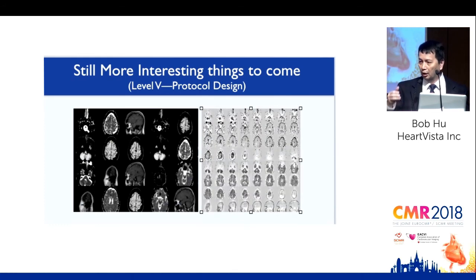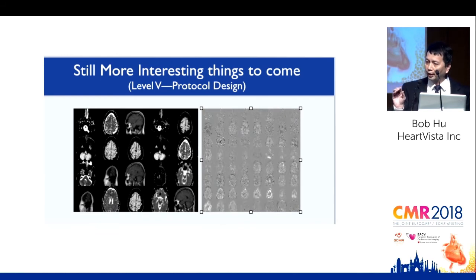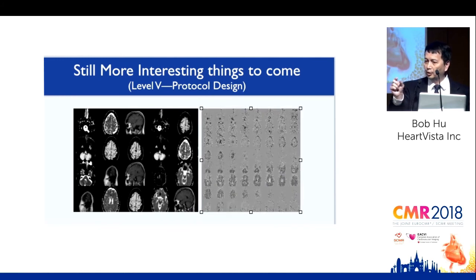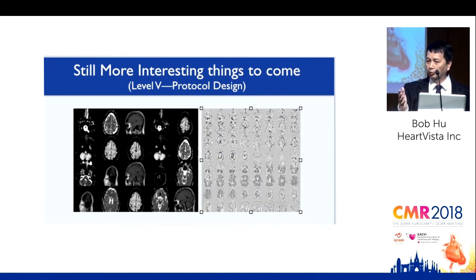This is very different from the standard classifiers that we use for machine learning, in terms of saying, okay, I've got a stroke, I've got a tumor, I've got something else. Here we're not doing that. We're defining the normal set from a pure information theory standpoint. We're trying to come up with what constitutes normal. Being able to define that, being able to define the parameters for that, and then allow that to eliminate the things that we don't want to see.